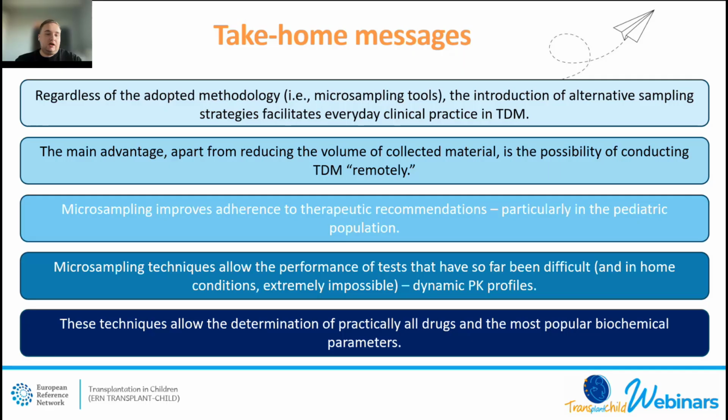Microsampling techniques allow the performance of tests which are difficult to perform in daily clinical practice. Some of our dynamic PK profiles were prepared in the hospital. Some of them were performed at home, so it's suitable for both hospital and home performance.